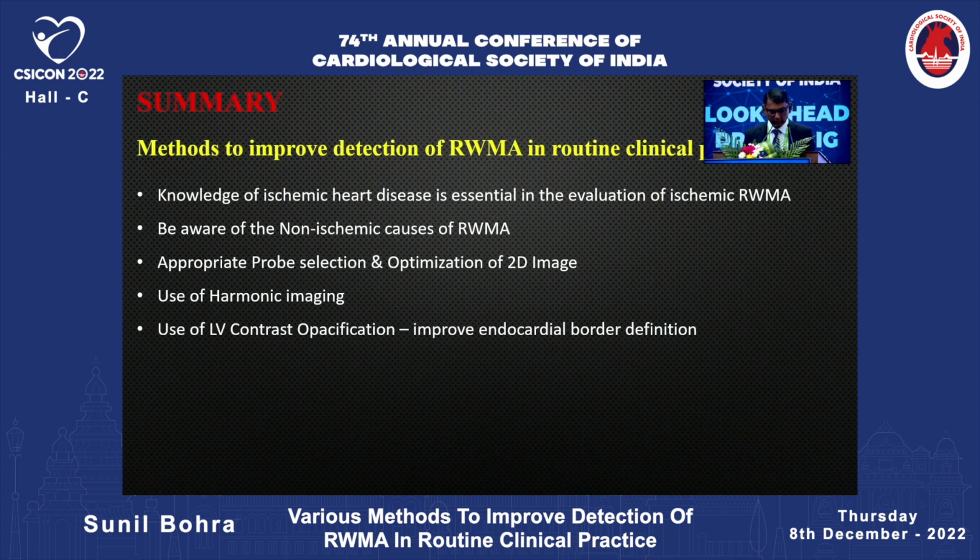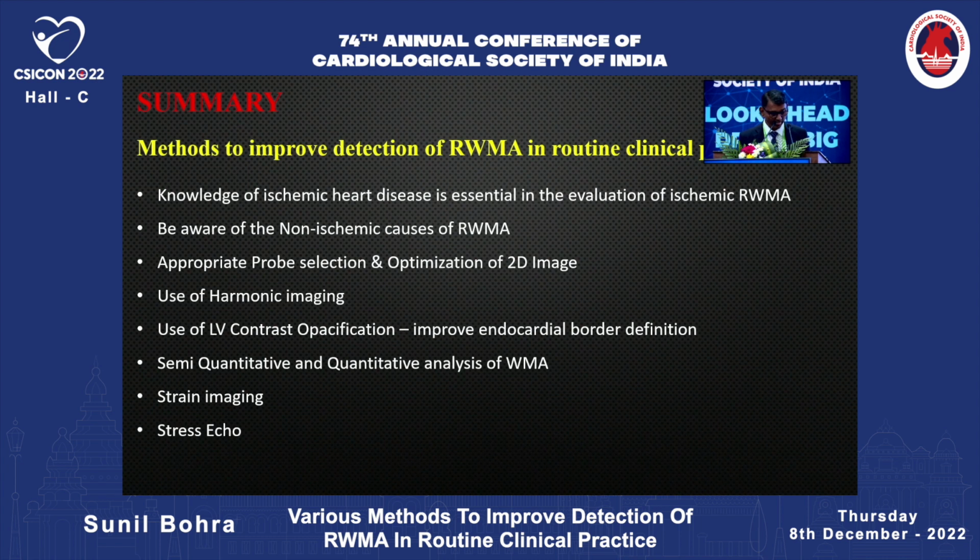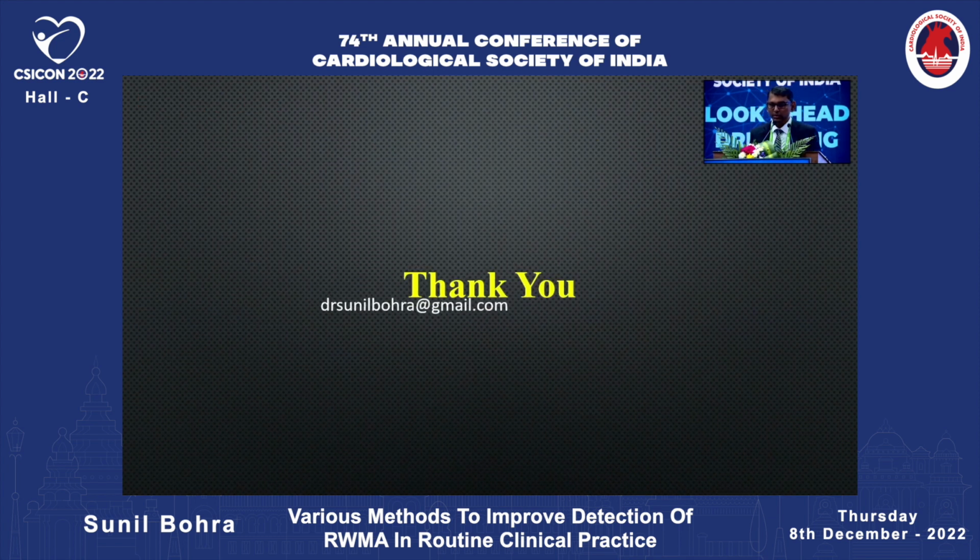Use of LV contrast opacification improves the endocardial border definition. Semi-quantitative and quantitative analysis of wall motion abnormality is recommended. Strain imaging, wherever possible, use it. And stress echo will definitely guide us in detecting new wall motion abnormality. So I'll end here. Thank you.